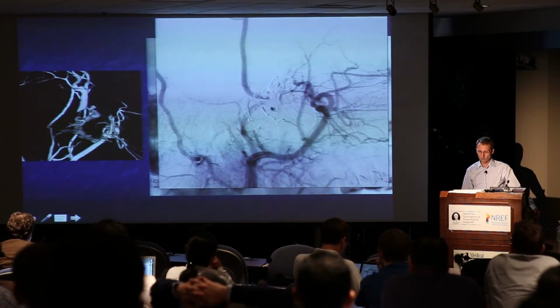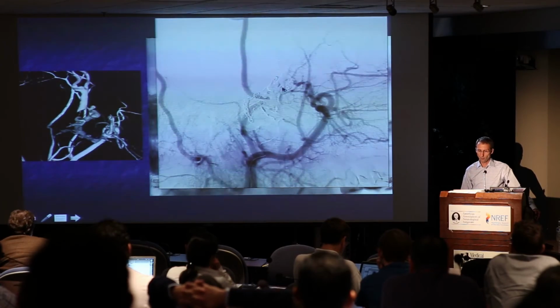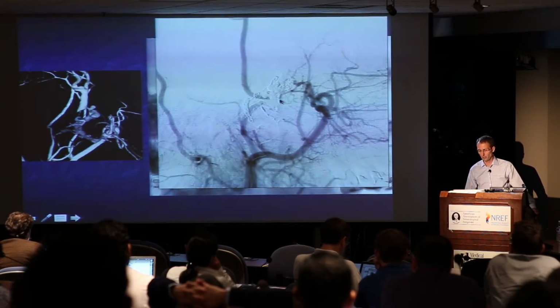Again, the dural fistula, we believe, is in this location. We filled the venous pouch completely, because again, you want to saturate the fistulous connection and get it into the main venous outflow, if possible, to completely eliminate it. And this is after, these are the coil mass in the MMA and the onyx cast, which hopefully you can see a little bit, that was cured.